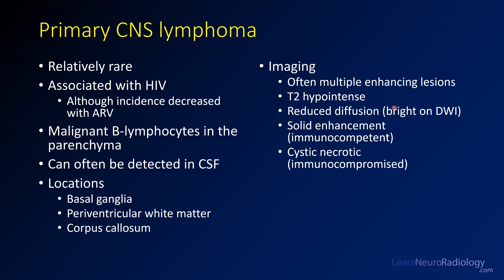On imaging you'll typically see multiple enhancing lesions. T2 hypointensity is a nice characteristic to look for, and you'll see brightness on DWI with reduced diffusion on ADC. Most commonly in immunocompetent patients there is solid enhancement, although lesions can appear cystic and necrotic in immunocompromised patients such as those with HIV.